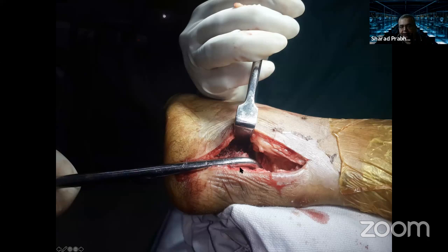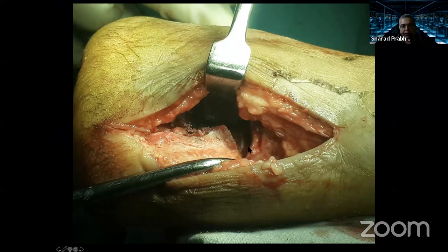You have direct visualization. You can manipulate your tuberosity fragment, get a bone hook in there. You can see the talar articular surface. You can usually see the articular surface of the calcaneus as well. You can manipulate the fragment as you want. So this is what we show here as a periosteum elevator. We're lifting the depressed fragment.